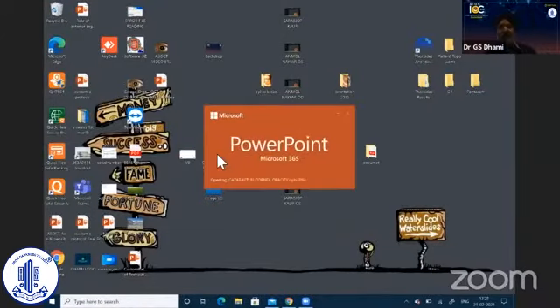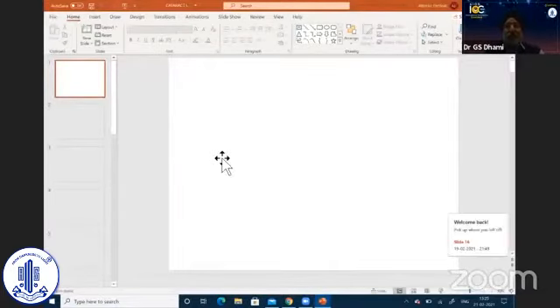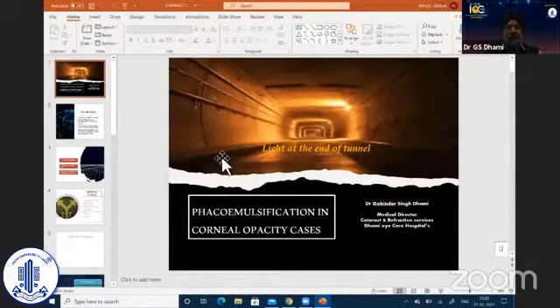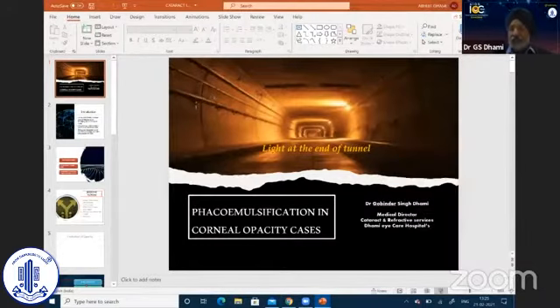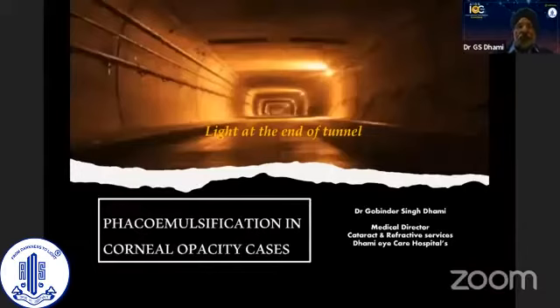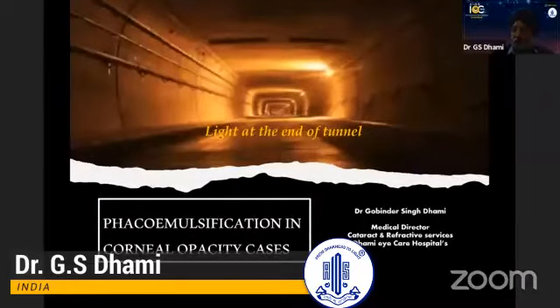After seeing so many powerful presentations of intraoperative OCT and manipulations inside the chamber, many times you feel you really don't see anything through the cornea and you have to do a phacoemulsification, especially in centers like ours where we do not have a cornea immediately available, and we don't have a corneal surgeon immediately to help.